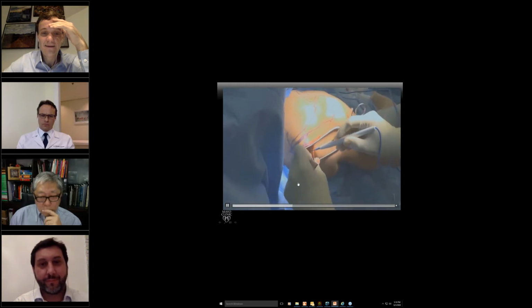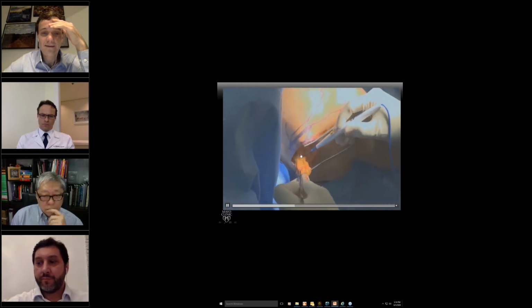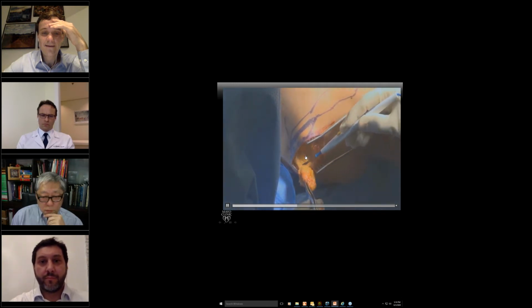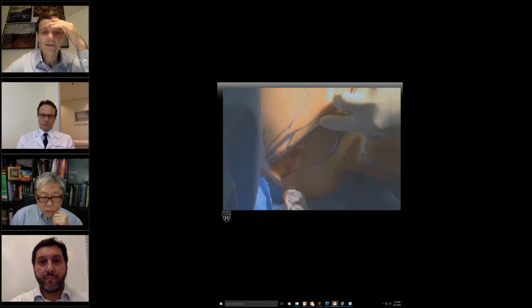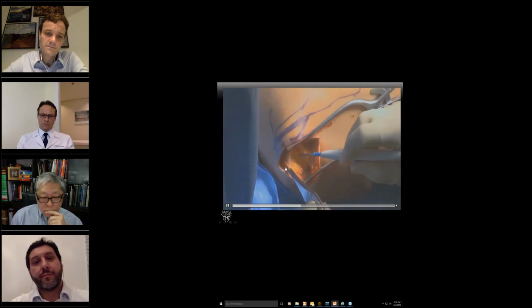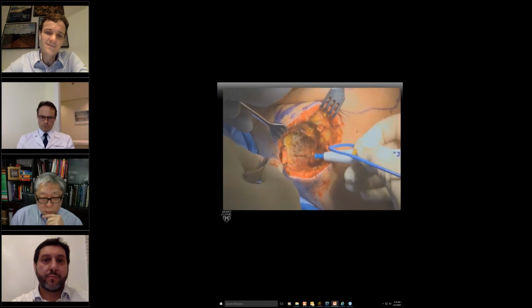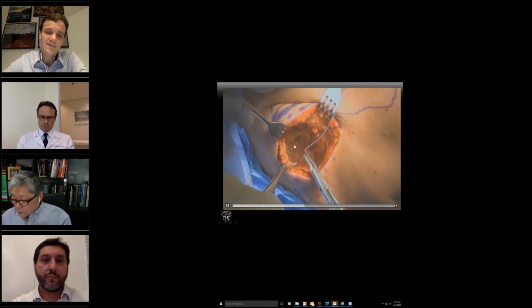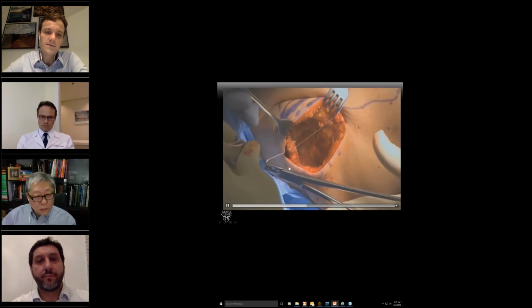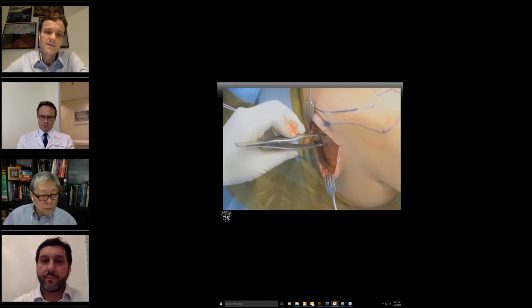I pull and pull. Look, this one I was lucky. Even from the first pull, I can almost see something like a tendon. You can see this. This is tendon and muscle. That will make you feel much better instead of just dissecting and assuming stuff, because you're pulling out on the fat. And now I put this retraction again just to make sure I'll be able to see. Now I can see it. And very sincerely, it usually doesn't take more than a few minutes if you do the steps correctly and you have good exposure. And I always put a suture on the lateral tendon, mostly to imbricate it, because later I'm going to pass the graft around and I want to pull on it to give it tension.